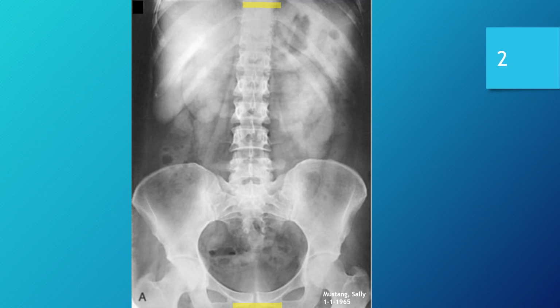And then on the upper portion of the abdomen, we have the margins for our left and right kidneys, and the margin for the presumed left kidney is right in this area, and then the presumed right kidney is right there. And then of course we know that the bladder is in this area here, and then ureters make their way down into the bladder. So yeah, absolutely, we have exactly what we want to see as far as required anatomy. So yeah, we hit the nail on the head there.